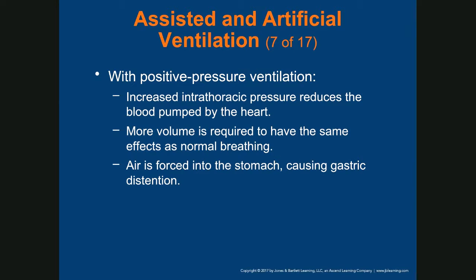So if our BVM technique is poor, we're going to get air into the stomach, and that's just going to make your life, well, I can't say make your life difficult. It's not going to be good for the patient, and you have a lot of work to do, right? So once you start to get air into the stomach, your job is going to become very difficult to manage the upper airway, right?